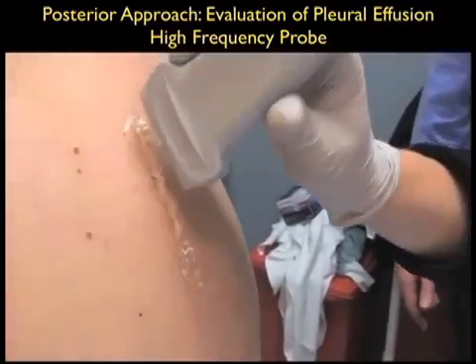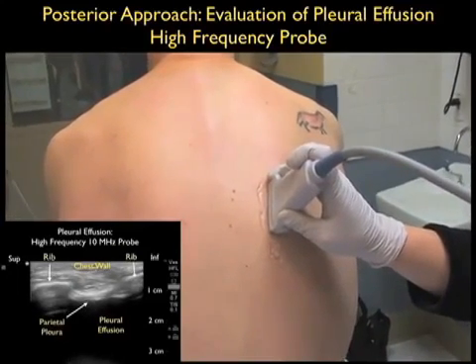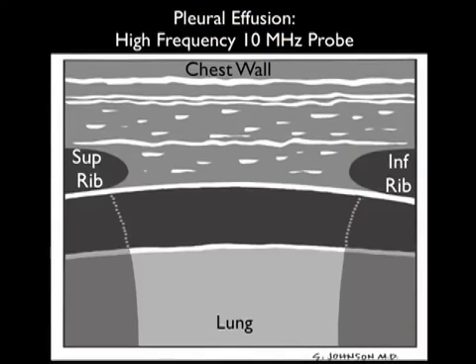A clinical pearl that can be very helpful in further delineating the pleural effusion with regard to the patient's anatomy is to look further with a 10 MHz high-frequency linear array type probe prior to the thoracentesis puncture. Notice here we're placing the high-frequency probe along the posterior chest wall in the long axis configuration with the probe marker swiveled towards the patient's head. We can also orient the probe in between the patient's ribs in the lateral orientation as well to further investigate the anatomy.